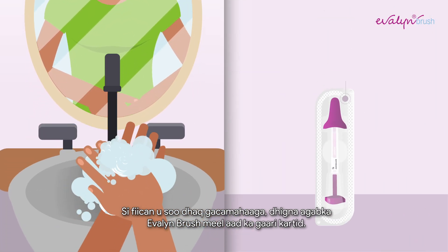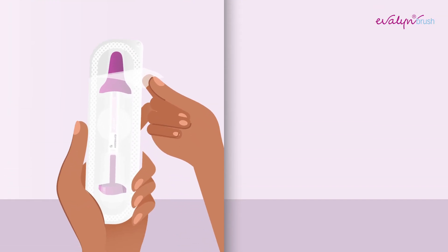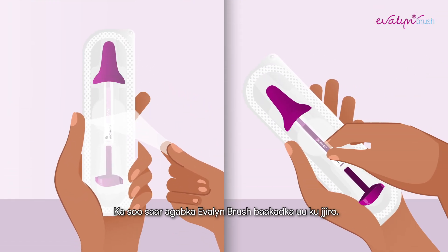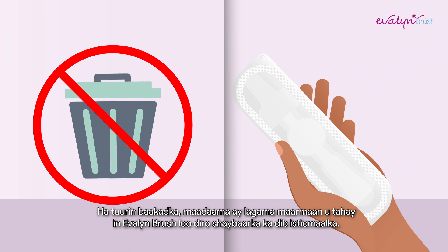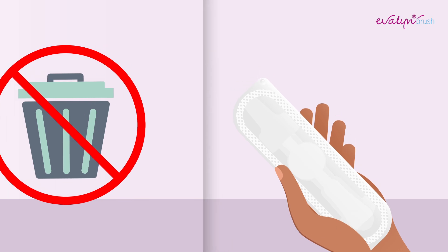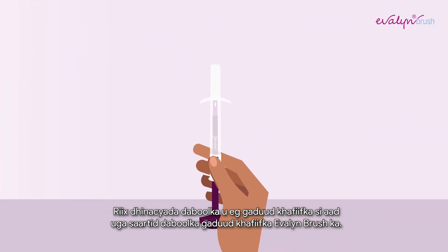Thoroughly wash your hands and lay down the Evelyn Brush within reach. Remove the Evelyn Brush from the packaging. Do not throw the packaging away, as it is necessary for sending the Evelyn Brush to the laboratory after usage. Press the sides of the pink cap to remove the pink cap from the Evelyn Brush.